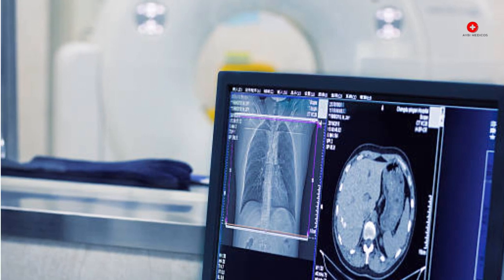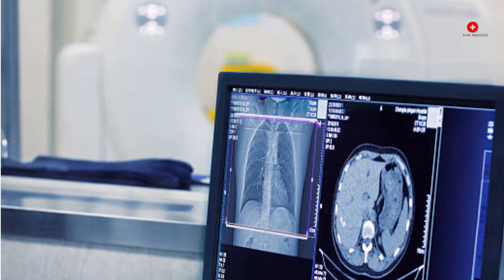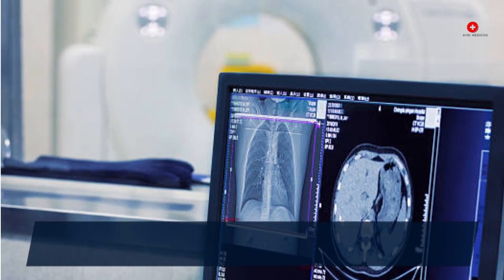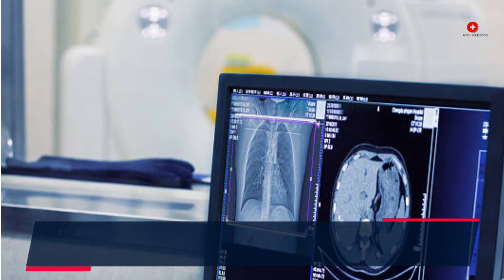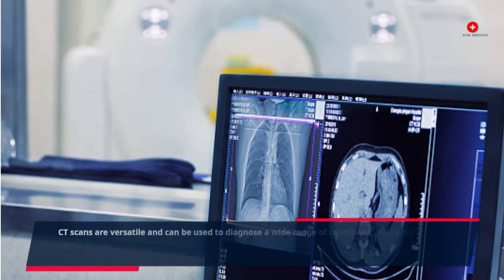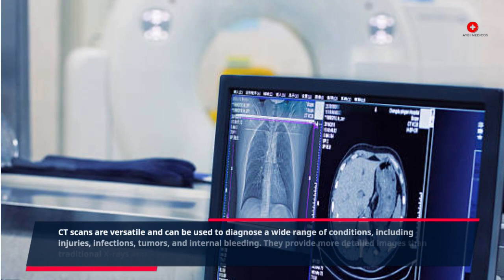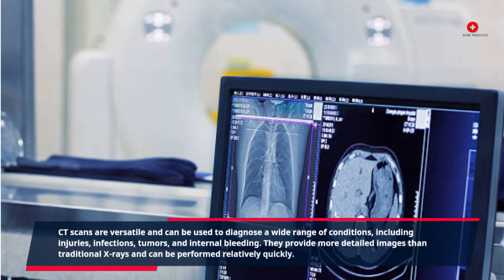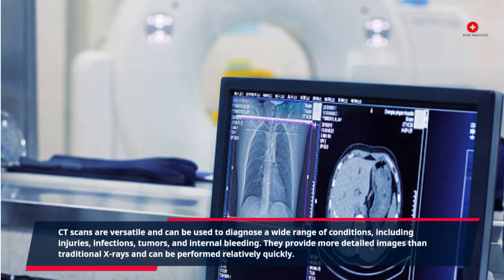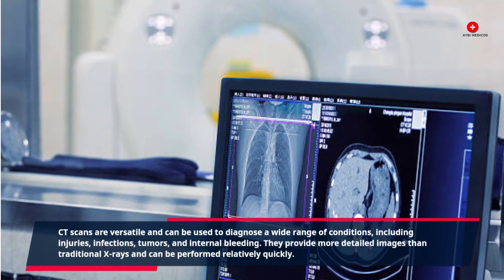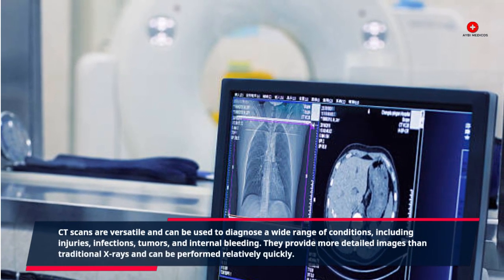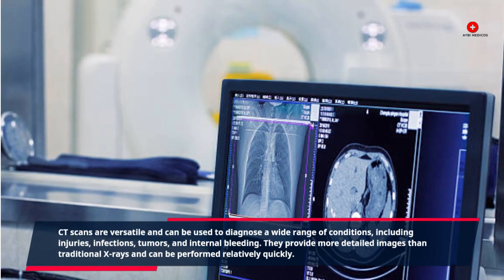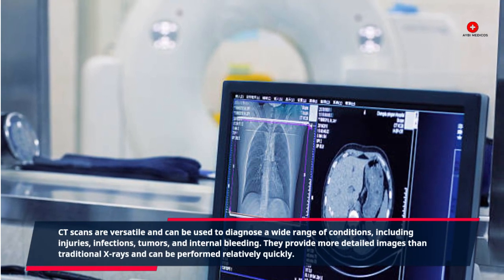CT scans are versatile and can be used to diagnose a wide range of conditions, including injuries, infections, tumors, and internal bleeding. They provide more detailed images than traditional x-rays and can be performed relatively quickly.